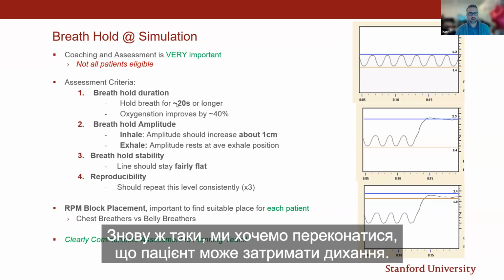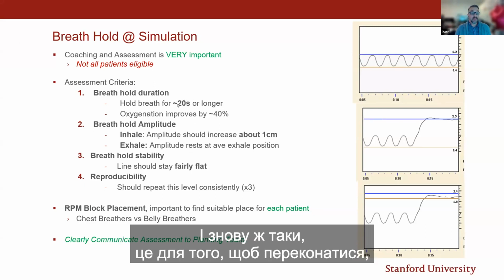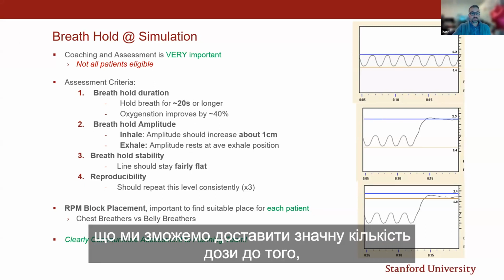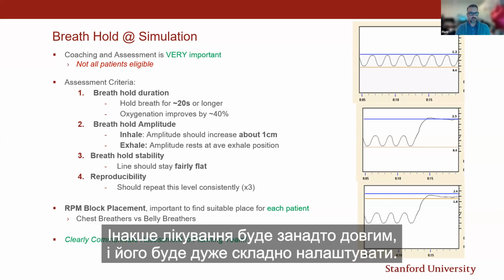And again, we want to make sure they can hold their breath. We kind of go around 15 to 20 seconds or longer, ideally. And again, that's to make sure that we can deliver a significant amount of dose before the patient needs to breathe again. Otherwise, treatments will just take too long and they're too difficult to set up.